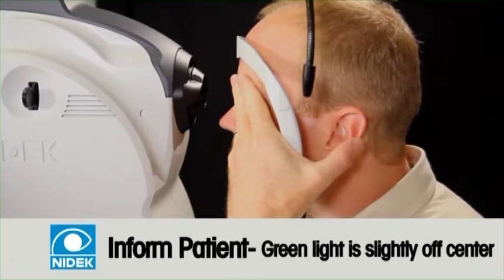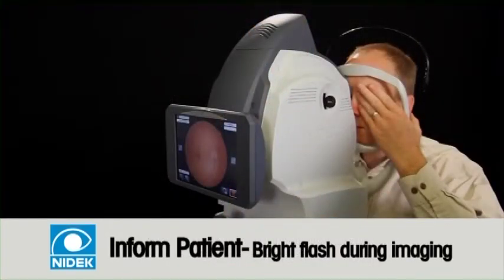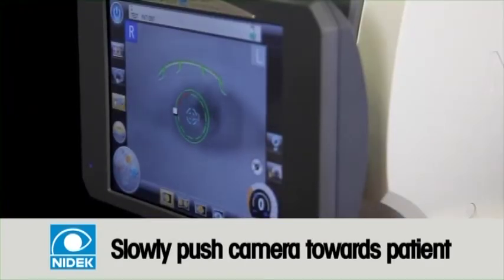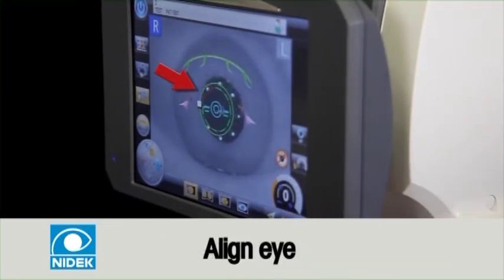Also, this is a good time to inform them of the few seconds it will take to complete the image and that the instrument will not touch or puff air into their eye. They will experience a flash as the image is captured. After you've entered in the new patient and they are appearing on the screen, select the Fundus icon. This is the default image type, and you will only need to choose this if prior you were taking a different type of image. Place the pupil markers over the white reflected dots and slowly push instrument towards the patient.